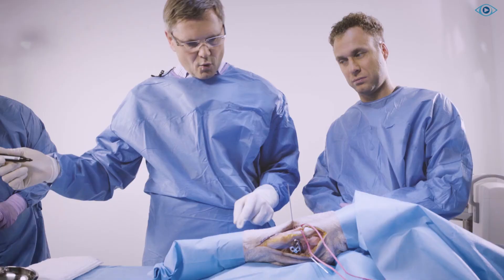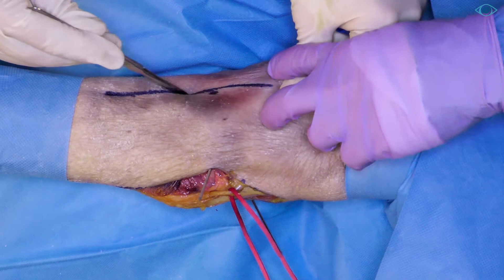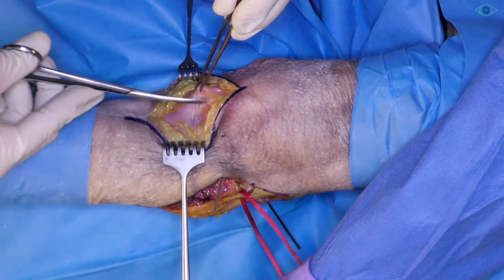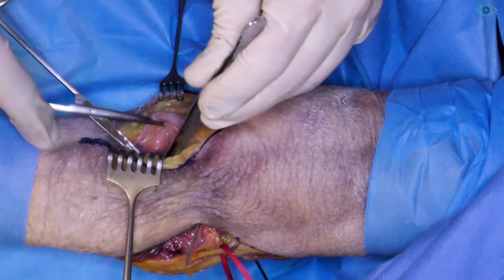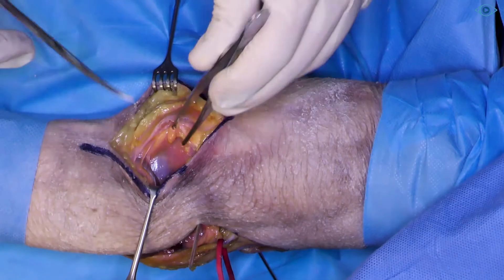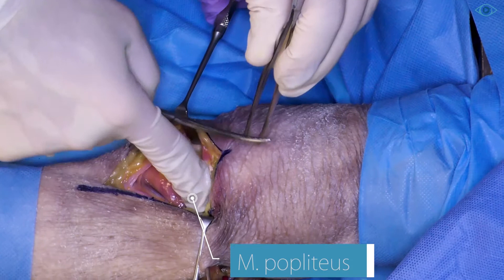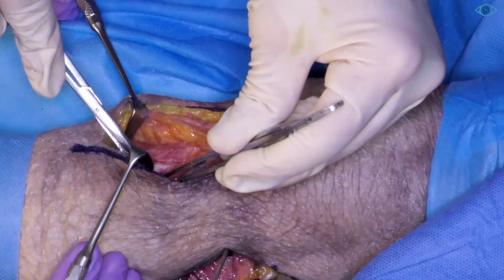To do so, we approach from the posteromedial. This is where we need to do our incision in order to dissect into the depth medially of the medial gastrocnemial head. That is the fascia of the gastrocnemius muscle where we start the dissection. We open it up here and have to pass the medial end of the gastrocnemius to then get to the popliteal fossa. Here you can see the aponeurosis of the medial gastrocnemial head again. We just hold it to the side and at the upper edge of the popliteal muscle, we open the deep fascia again and work ourselves further into the depth. We can already feel the tibial head here. The plate needs to be positioned posteromedially, directly behind the popliteal muscle.